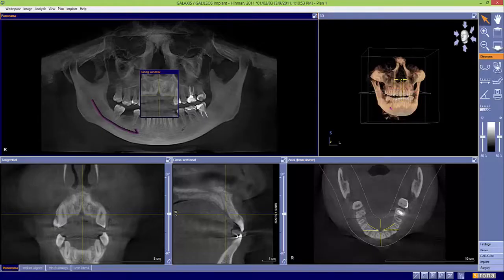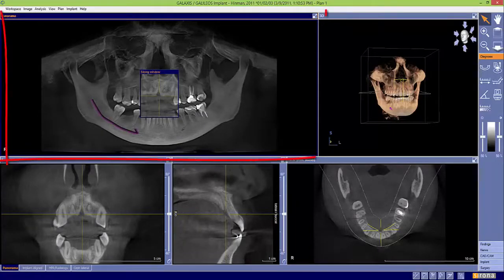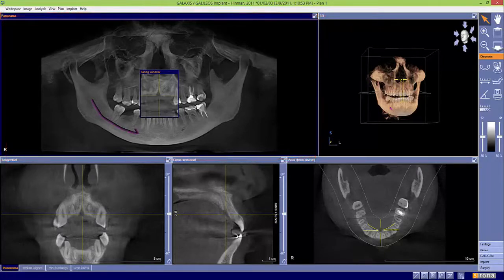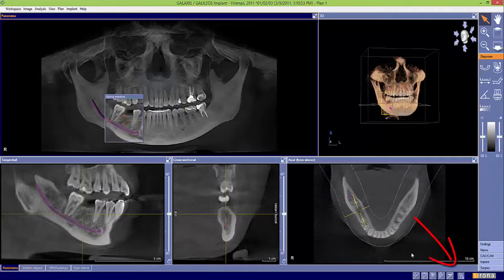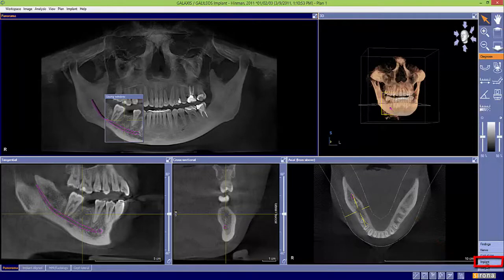Now we're ready to place a single virtual implant. In the panorama view, double-click on the edentulous space, then grab your implant license, then move to the implant tab on the right.